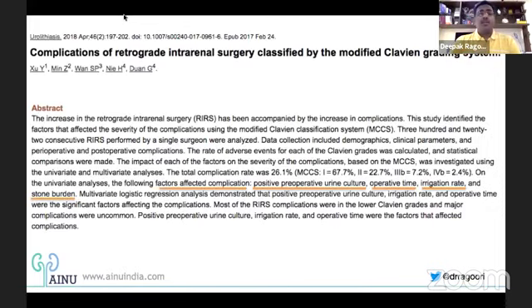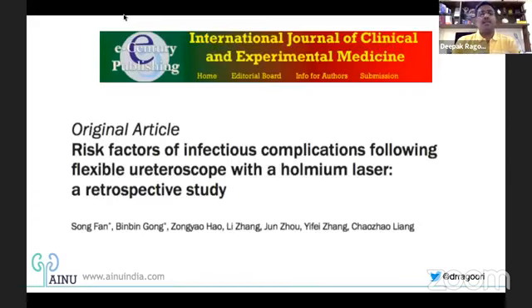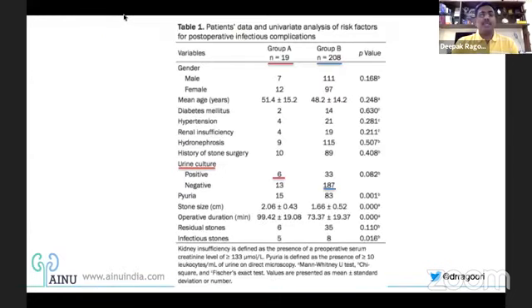When I said urine culture positivity as a relative or a probable contraindication, I'm going to quote a couple of articles where they say that factors that affect complication rate, like we all know, positive preoperative urine culture is something which we would normally wait on, maybe give a course of antibiotics and then take up the case. But having said that, there is another paper which comes out saying the risk factors of infectious complications following flexible ureteroscopy. This is a place where you normally see a study where there are around 19 patients of the entire data who have landed up with infectious complications.